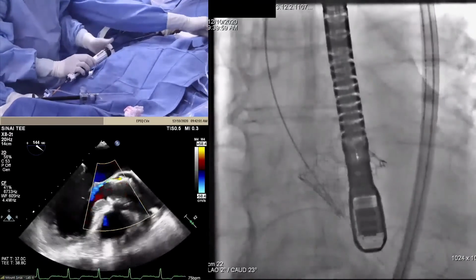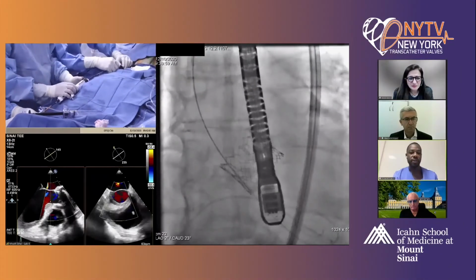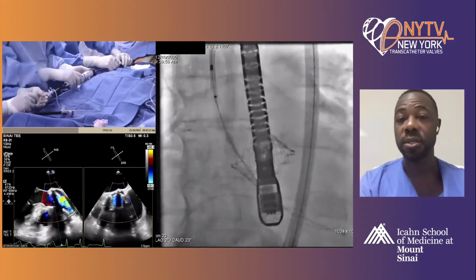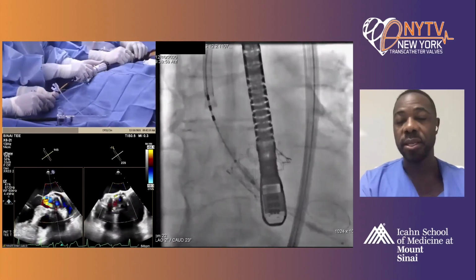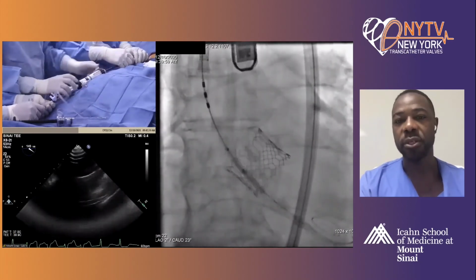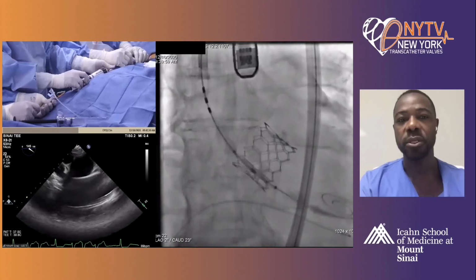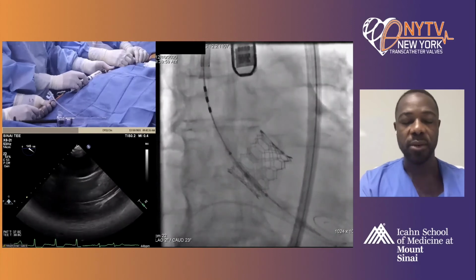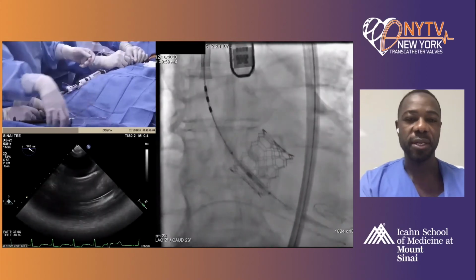Didier, Eberhard, Alex. I believe that in this case, there is a need for post-dilatation, but I think that there was one thing that could have been done slightly different in the CT analysis, which is understanding the configuration of the supraannular region. Because if you have something that is way larger than the annulus, you're not going to get a device that is going to seal properly. So if you have a tapered configuration, the risk of the ability to seal everything with the supraannular region makes sense. Here, probably we have a flared configuration, so there may be a residual regurgitation because it's a very large anatomy. But it's already a very nice result, I have to say.